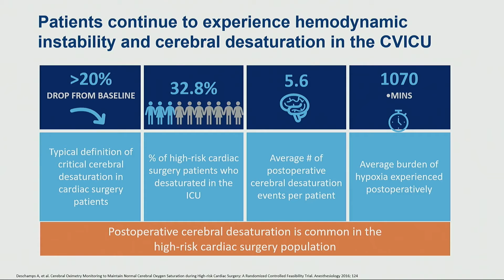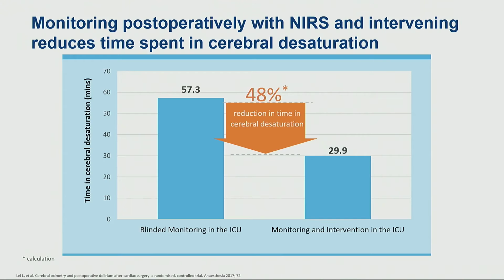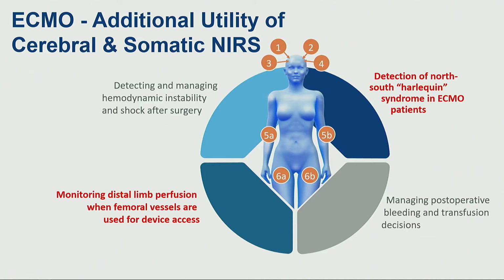So yes, my patient has cerebral desaturation. We don't pick it up, but does it matter clinically? Before I get to that, there are studies such as this one right here where they compared blinded versus unblinded cerebral oxygenation monitoring. In the monitoring and intervention arm, there was nearly a 50% reduction in time spent in a desaturated state, okay?